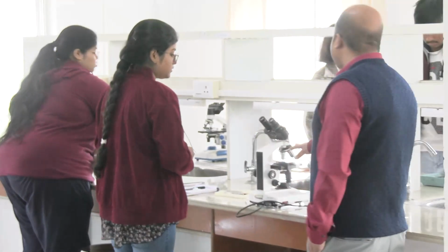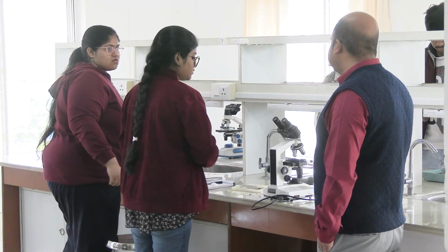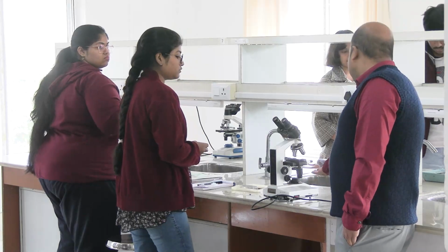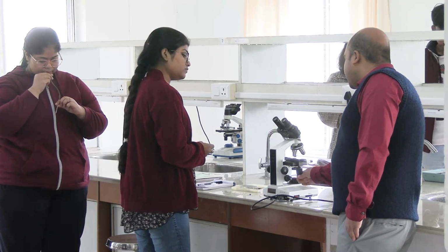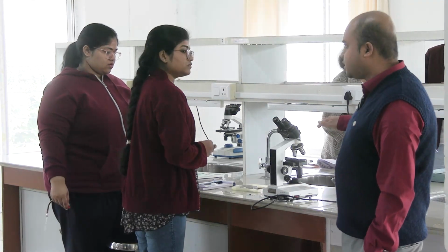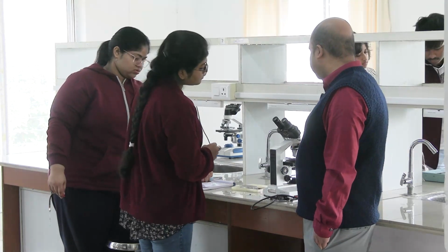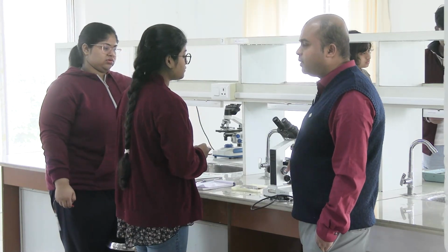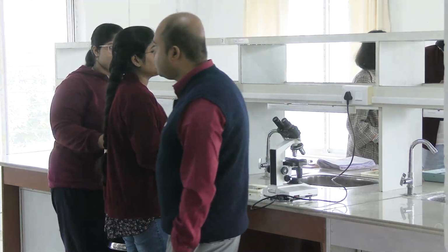With 40x, when you do it... here 100x will not be needed for RBC. In case of RBC counts, 10x and 40x will be used. Whenever focusing is done with 10x, you have to adjust the condenser position to the lowest. And when it is 40x, then the condenser position has to be somewhat in the middle. When it is the 100x lens, this one, it is written over here, that is called the oil immersion lens, not required for this experiment. Then the condenser position is highest. It is required in the differential leukocyte count.